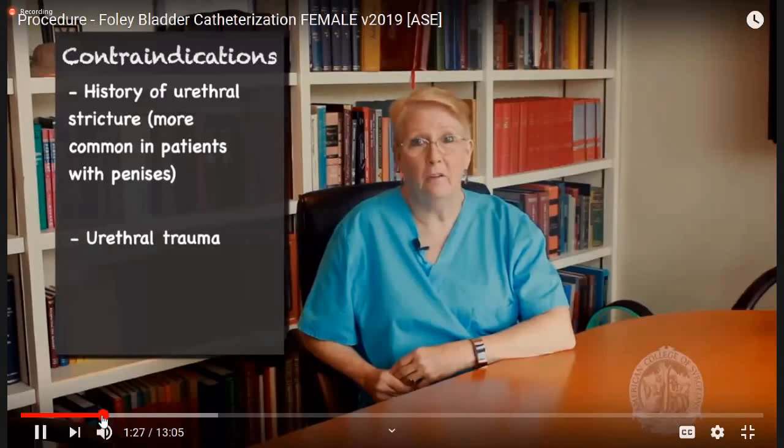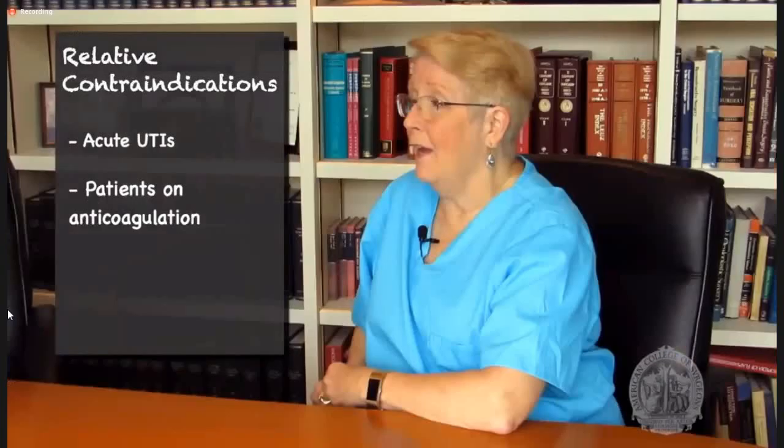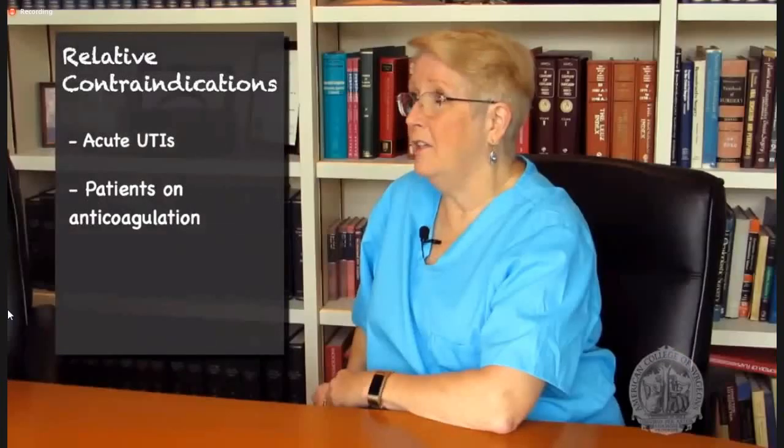Or perineal or scrotal hematoma or ecchymosis. Relative contraindications include patients with acute urinary tract infections and anticoagulated patients. Catheter-associated urinary tract infections, or CAUTIs, are a huge source of nosocomial infection and medical spending, so always think carefully if your patient truly needs an indwelling bladder catheter.